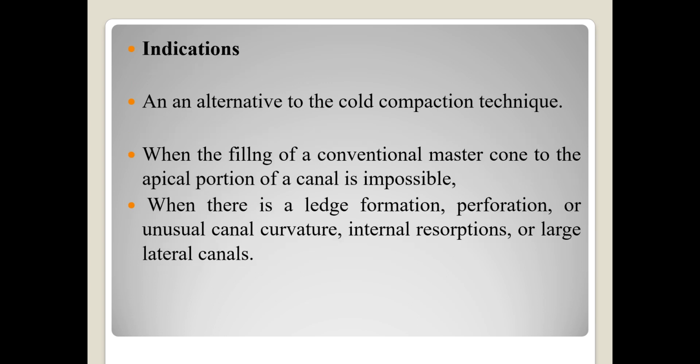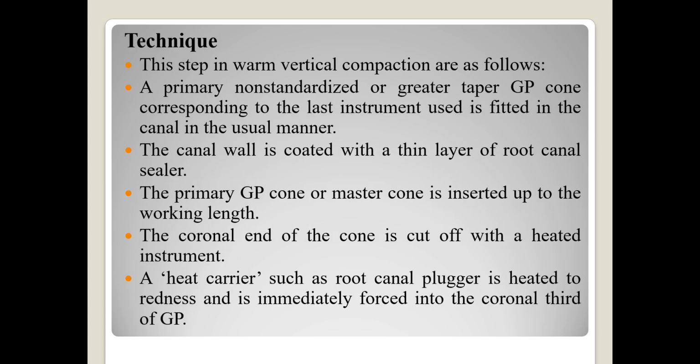Indications. As an alternative to the cold compaction technique, when the fitting of a conventional master cone to the apical portion of a canal is impossible, when there is ledge formation, perforation, or unusual canal curvature, internal resorptions, or large lateral canals. Coming on to the technique.